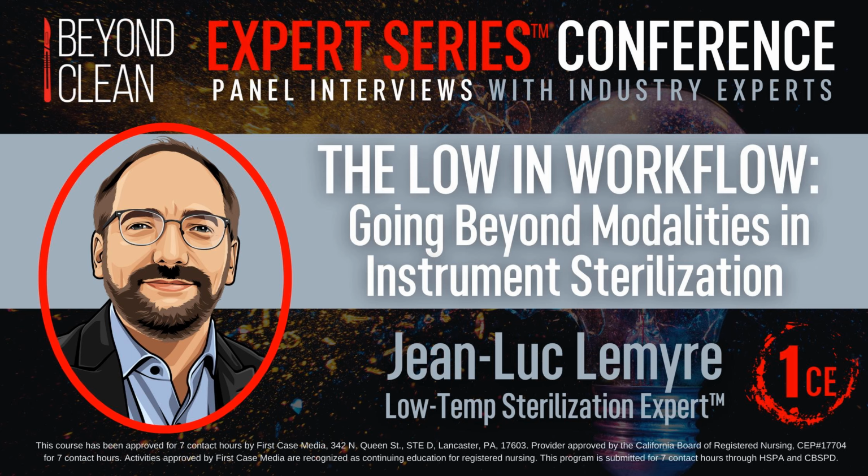Yeah, it's just interesting from a standards perspective, all of the consideration that goes into monitoring ETO, ethylene oxide sterilization. But when you look into the lethality and the effect of the sterilants between hydrogen peroxide and ethylene oxide, they both are very dangerous to people. And so I've always thought it peculiar that we have all of these requirements for monitoring one, but none for the other. But to your point, it is good to know that there's a lot of design and development that goes into keeping our users safe.